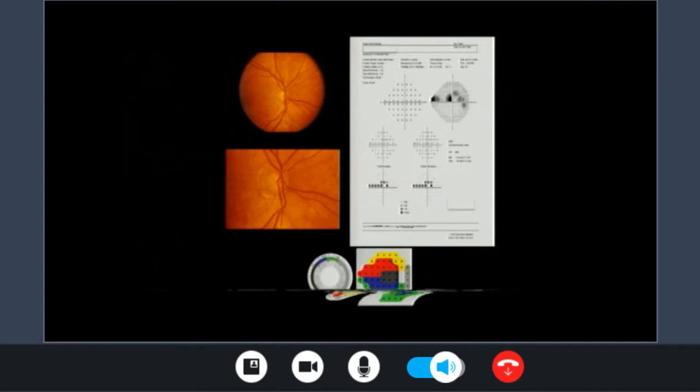Now we'll go for the N, is it normal or abnormal? Looking at the grayscale, we realize that this patient is having an abnormal visual field. Okay? Then we will look at the D. So the D stands for what? The defect pattern. You look at the mean or total deviation, then you look at the pattern deviation. The changes are still there. So what kind of defect pattern are we having here? It's a scotoma. Let's agree on one thing, this is a scotoma, right?